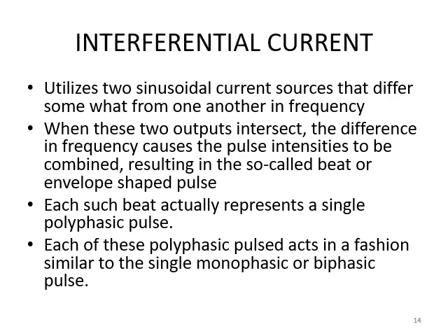The original frequency of this interferential current channels, we call them the carrier frequency, is within the medium frequency range, usually 4 kilohertz, sometimes 2 kilohertz. And when these frequencies are interfered, they produce this progressively increasing and decreasing pulses.